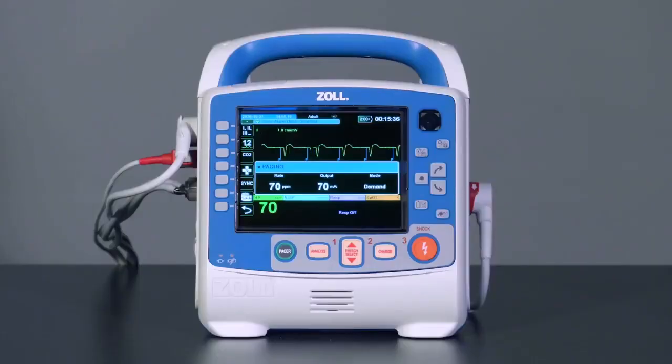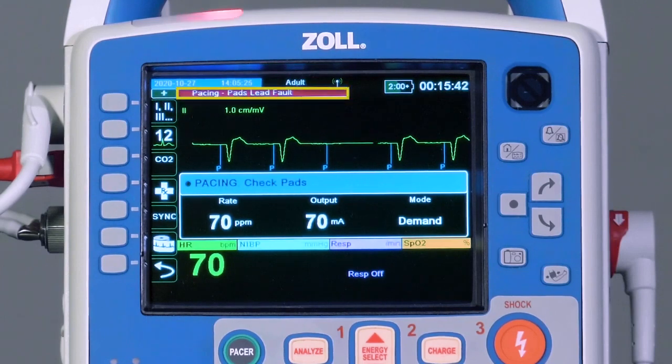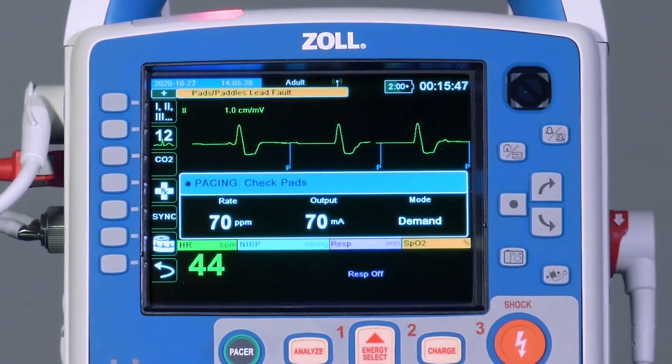If a multifunction pad is removed from the patient during demand pacing, the X-Series Advanced will activate a high priority alarm and display a red alarm message, Pacing, Pads Lead Fault.